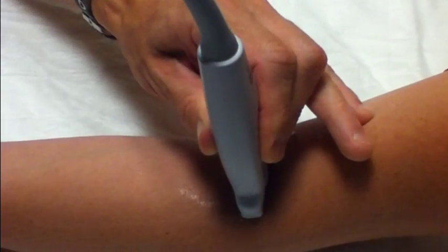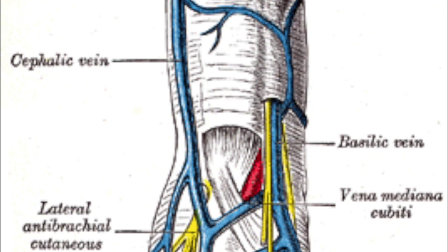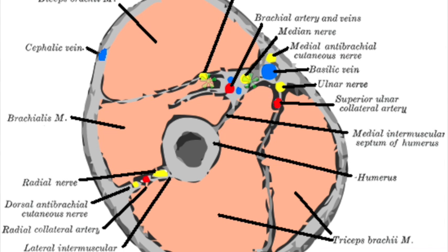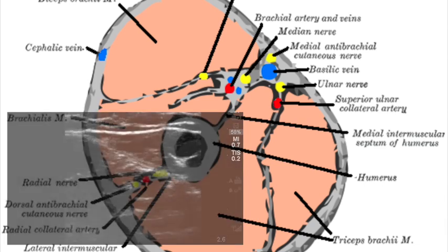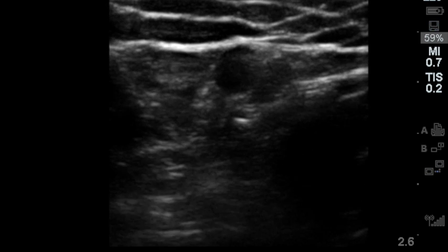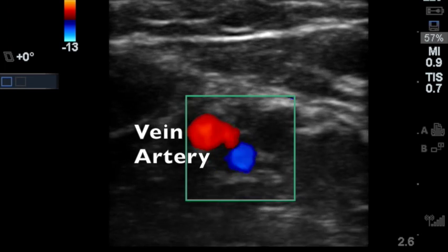I have two techniques for ultrasound guidance depending on how deep the vein is. I start by scanning around the antecubital area and looking for common veins: first, any veins in the antecube itself — sometimes these are present even if they can't be felt. Second, the cephalic vein, which is quite superficial and runs up the front of the arm. Third, the basilic vein, which is a bit deeper and runs along the inside of the arm. Fourth, the deep brachial veins — actually a triad of two veins and one artery — which runs deep to the basilic vein along the inside of the arm. Be sure what you're aiming for is a vein, confirmed by the fact that it is easily compressible. The color on Doppler shows direction of flow, not artery or vein — just by rocking the probe, you can turn it from red to blue.